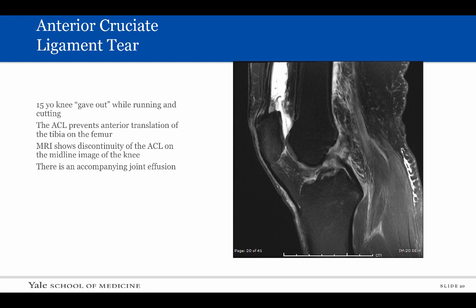This is the case of a 15-year-old whose knee gave out while running and cutting. On this sagittal midline MRI image through the knee, we can see that the anterior cruciate ligament is disrupted and is displaced inferiorly onto the tibia. The yellow line depicts the normal position of the anterior cruciate ligament. The bright signal above the patella represents the knee joint effusion.